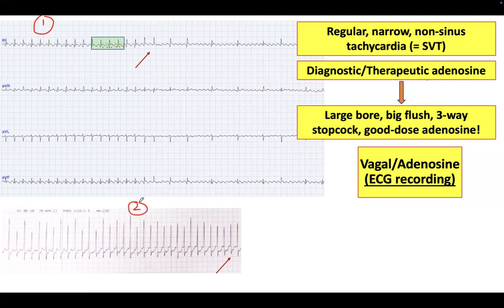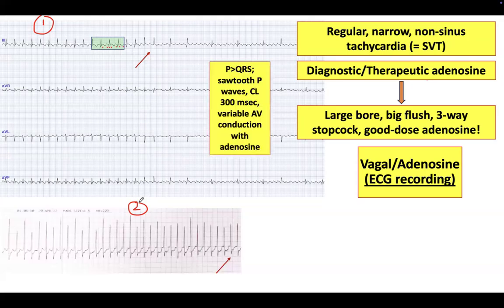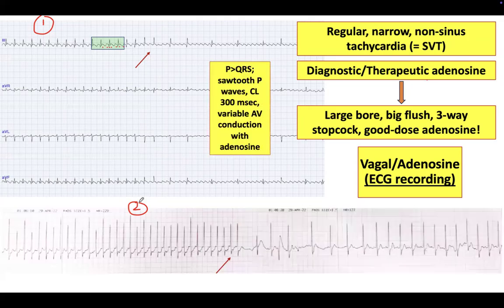It's just one lead, but it's a narrow complex, right? Very rapid. So narrow complex tachycardia is super rapid. It's like maybe 250 beats per minute. So even just the rate is against sinus tachycardia. You cannot see P waves super clearly, but the rate suggests SVT. You give adenosine and you terminate the rhythm into a PQRS rhythm with a narrow complex.